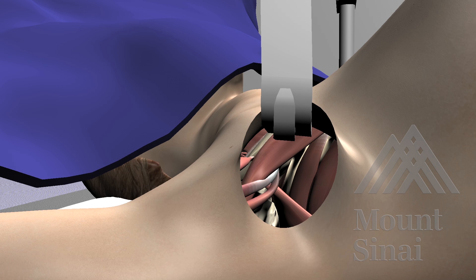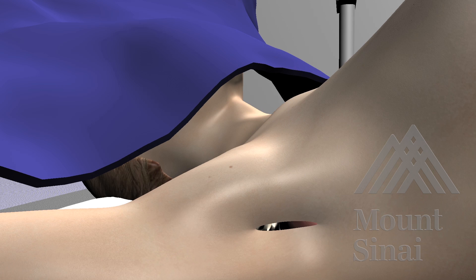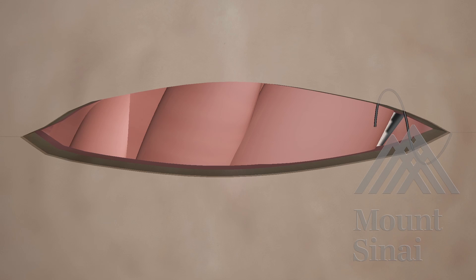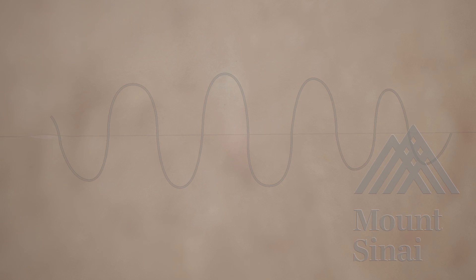Remove the thyroid retractor and any remaining instruments. Close the axillary incision in layers using a running 3-O vicryl for the subcuticular layer and a 4-O monocryl for the skin.